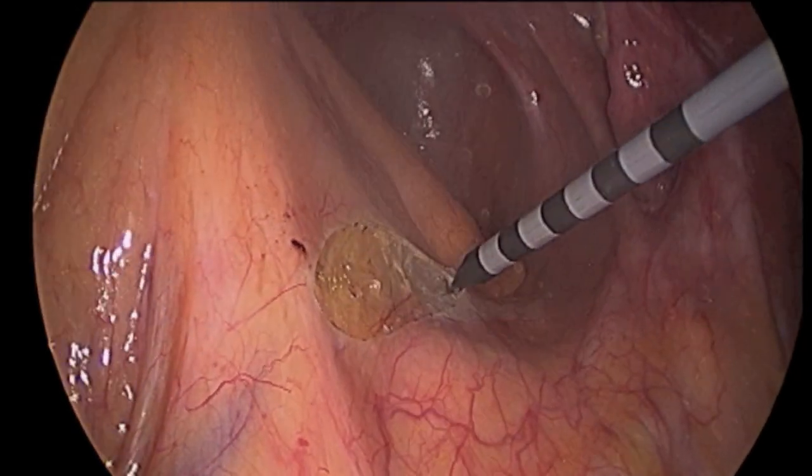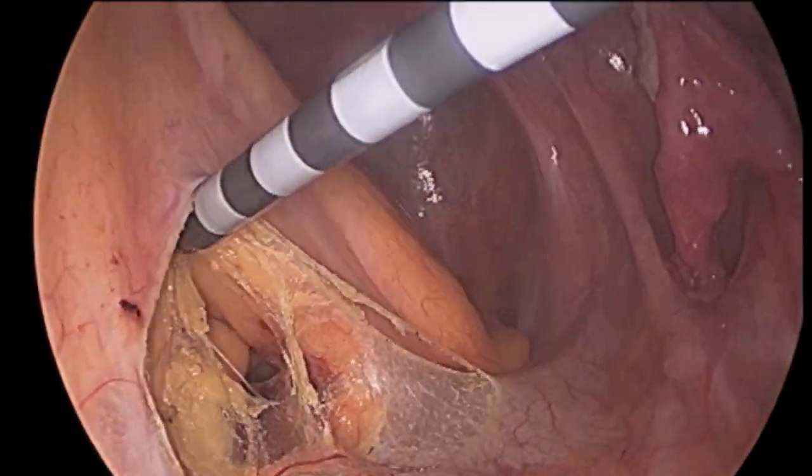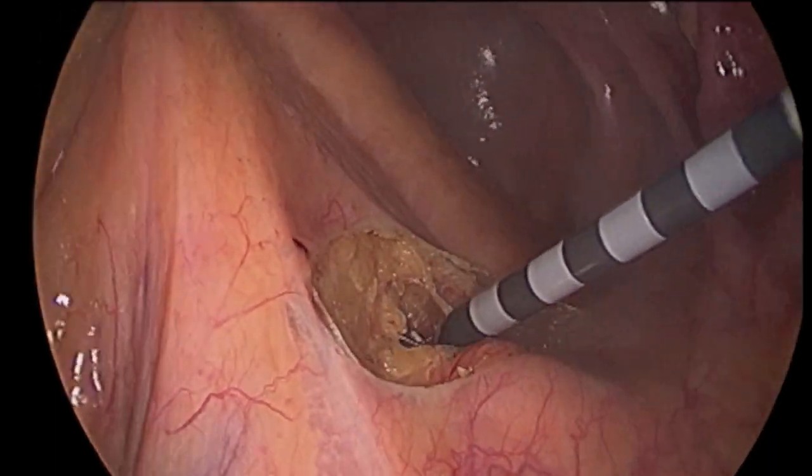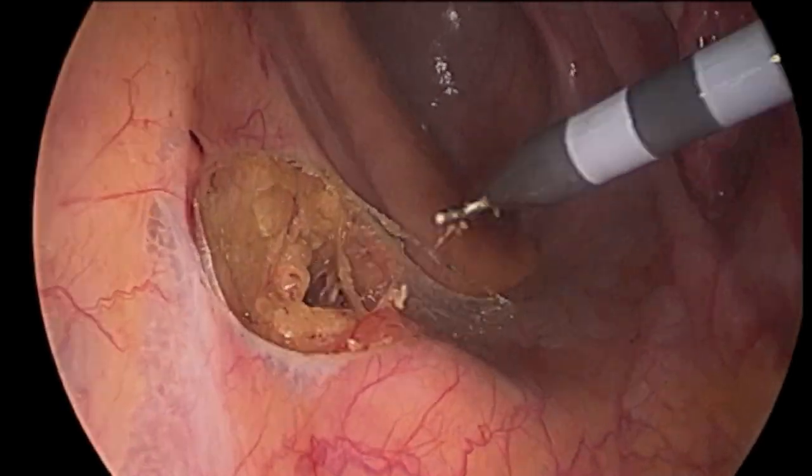Next, the right hypogastric nerve trunk is identified and preserved. As long as either the right or left nerve is preserved, the patient's ability to experience sexual orgasm following surgery should be intact.